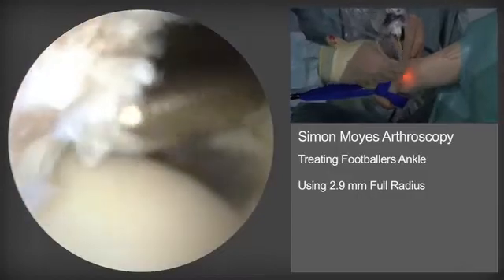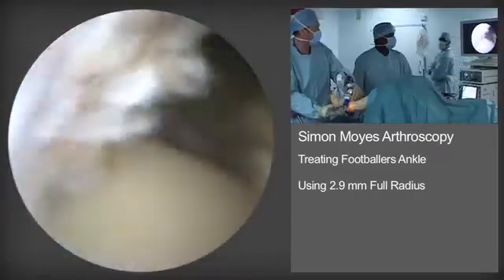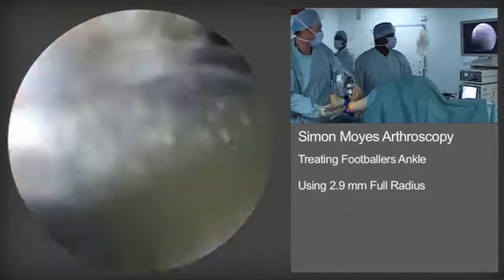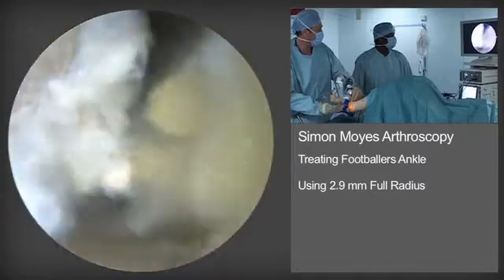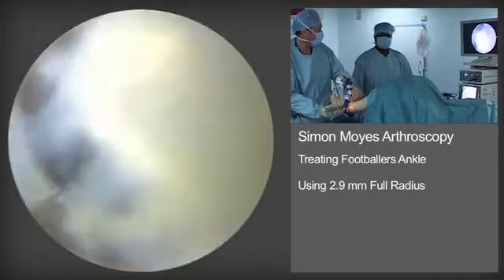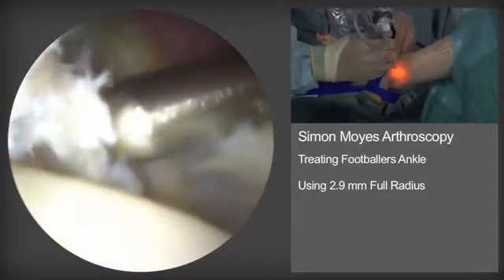The yellower element of the tibial spur is the bony element of it. It is cleared inferiorly and superiorly so that later the bur can be used to remove the bony spur and restore the normal tibiotalar angle.